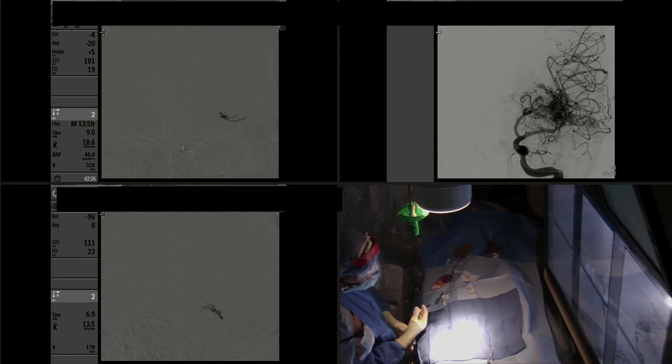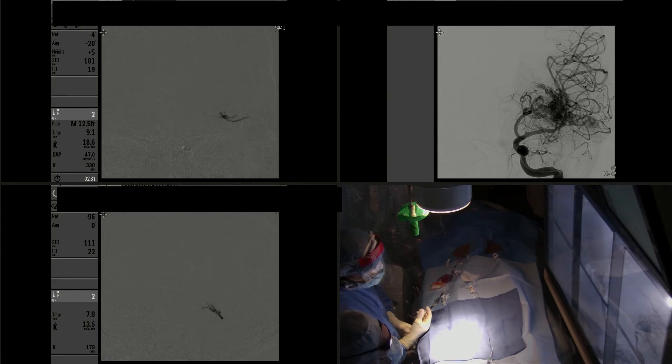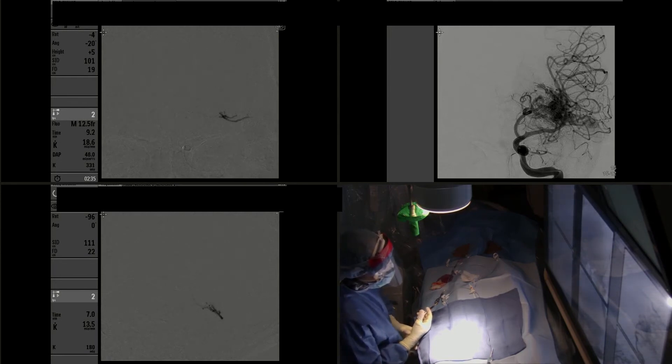It's important to note how slow we inject the Onyx. What we're looking for is penetration into the nidus.